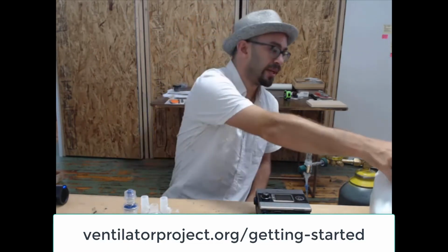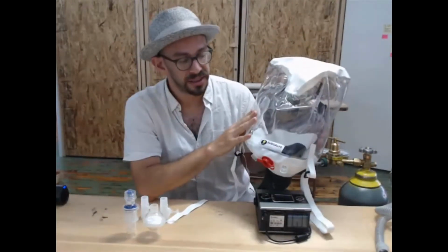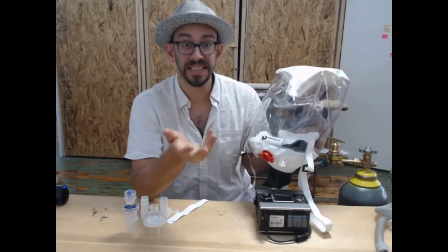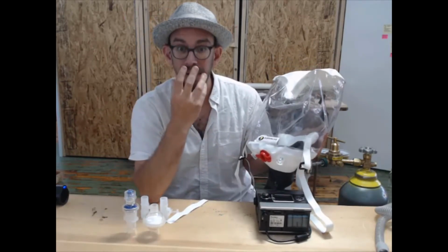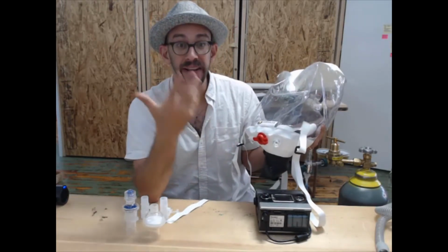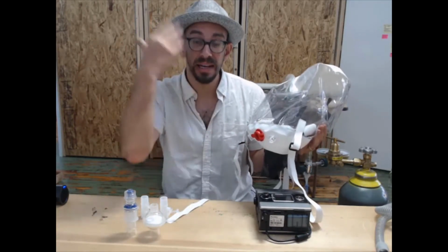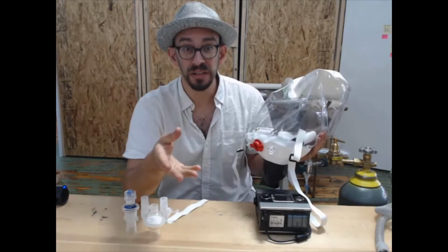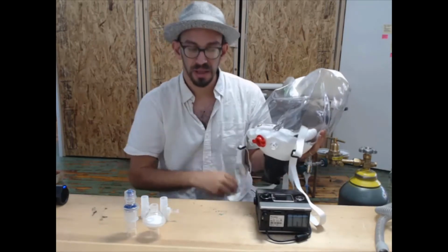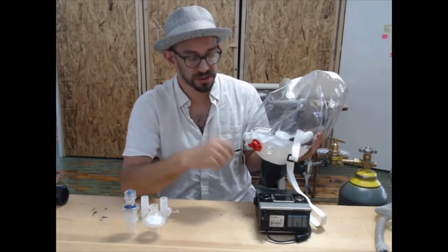The other part to it is the oxygen treatment hood. So this oxygen treatment hood is similar in many ways to a common vented mask that you may have used with a CPAP or BiPAP before. The key difference to it is a vented mask is releasing the particles from a patient's exhaled breath into the room. And in the case of COVID, we're very cautious about this. The WHO has recommended not to use vented masks because there is a risk of exposing healthcare workers to virus.